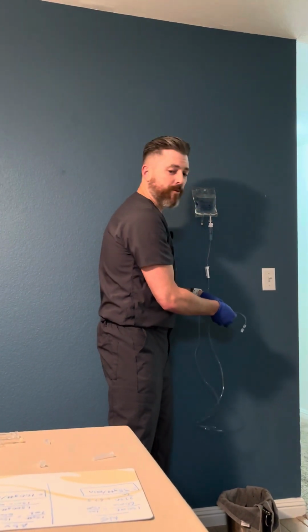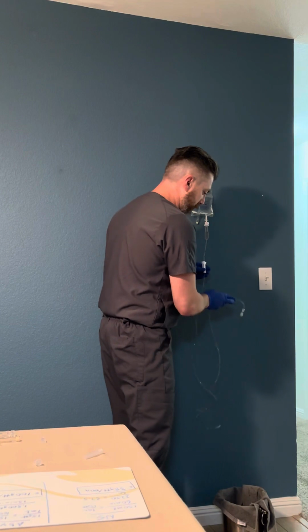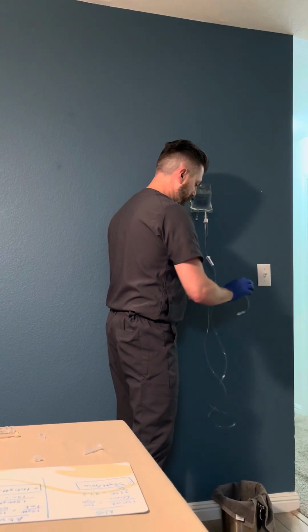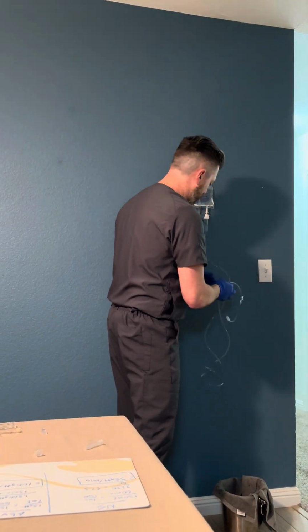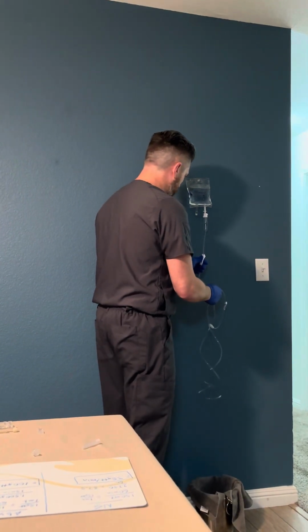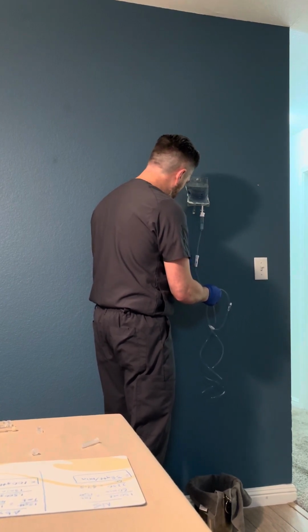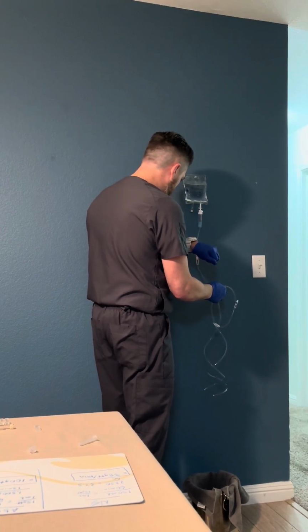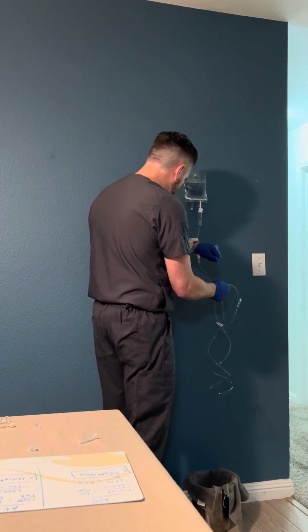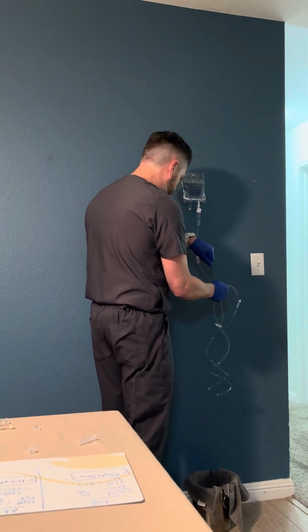I'm going to then be counting for a full minute. It's going to be our 38 drops per minute. So I will count that in real time. Open it up. Starting now.